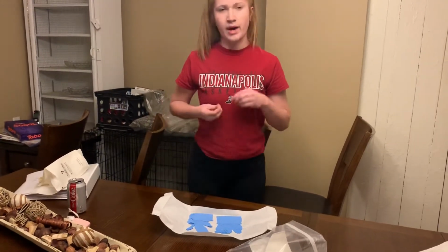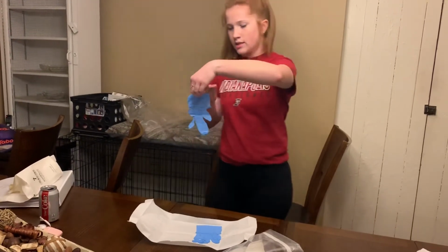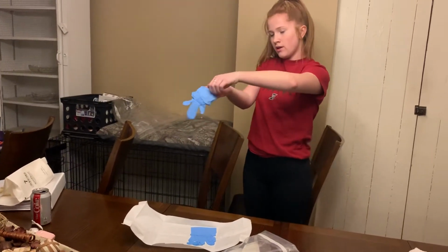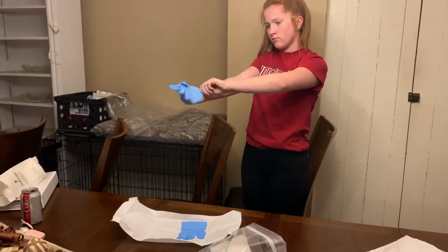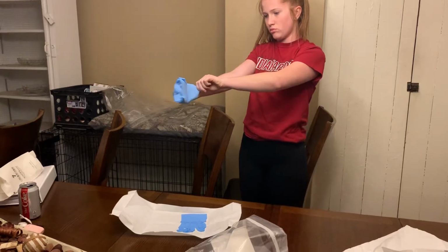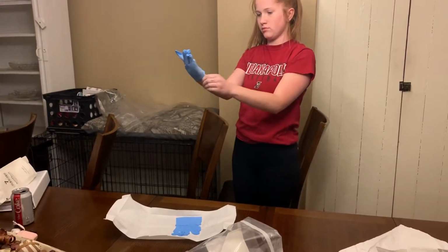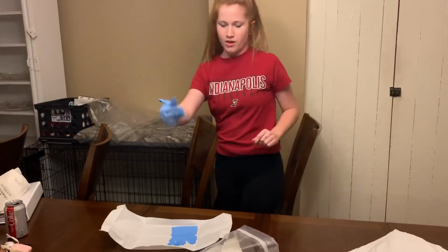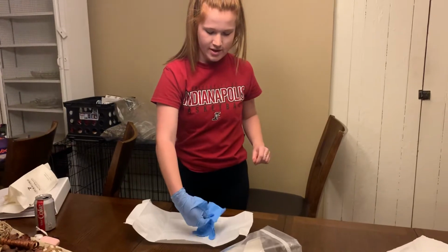So I'm going to glove my dominant hand first. I'm going to pick my glove up and step back and insert my hand into the glove without contaminating it. Okay. And then I am going to glove my non-dominant hand before fixing this other glove.